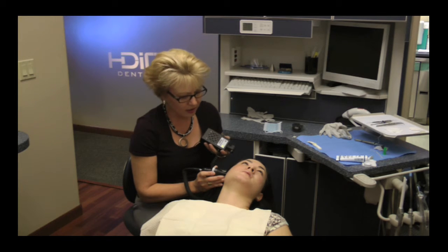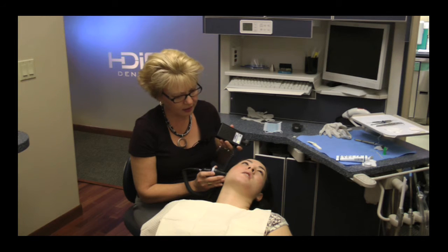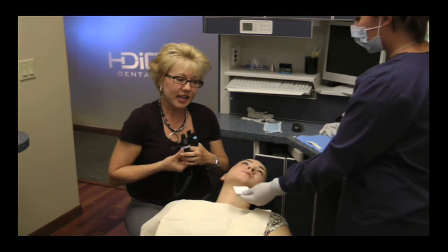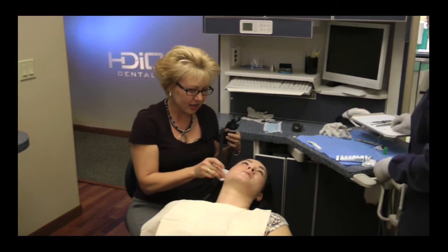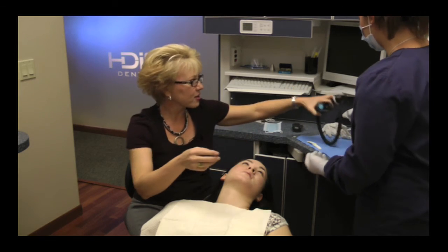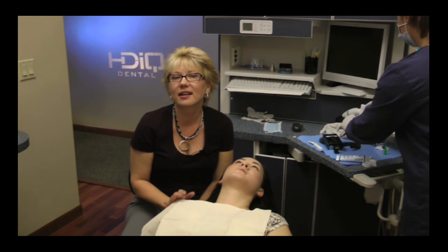from the Doppler. So Katie, I'm going to have you move to the left about a second over and a second back. And back. And a second over and a second back. So she has that same crepitus on translation in her lateral movement as she does in her wide opening. So then we're just going to remove the Doppler gel, and classically, if we were doing a full exam on Katie, we would repeat that on the other side.